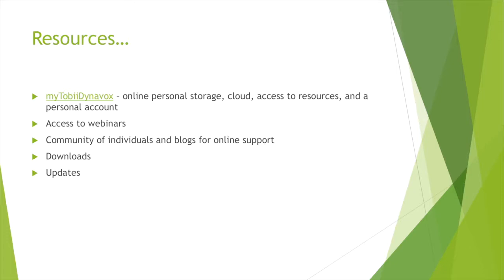The website itself does so much. I'm still looking into if you're able to create page sets online and transfer them to the device itself. This is something I'm still working on, so later on or in another presentation, I'll have more information on that.